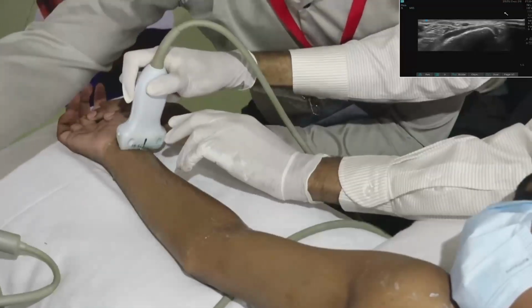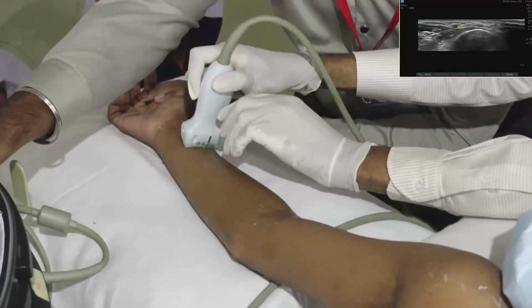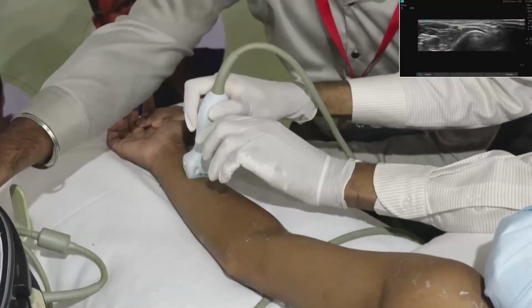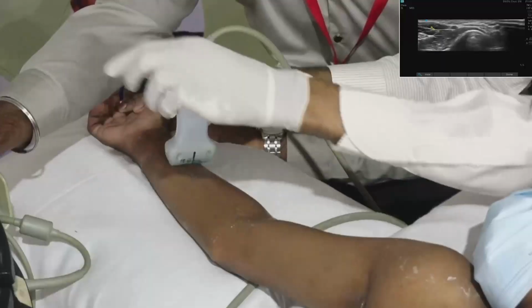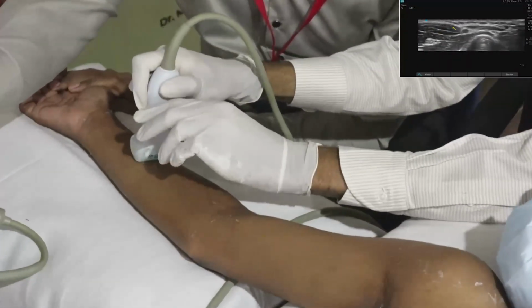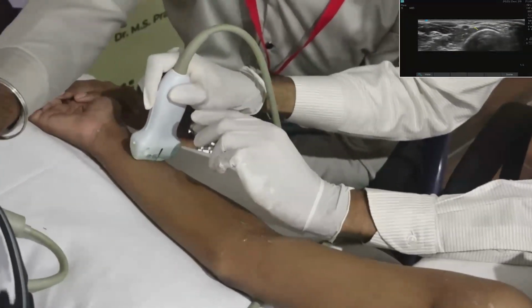So radial artery, if you are tracing, we are not looking for any nerve. First we are looking for radial artery only. One muscle is becoming bigger next to that, the muscle brachioradialis. If I move again distally, it is becoming like a tendon.